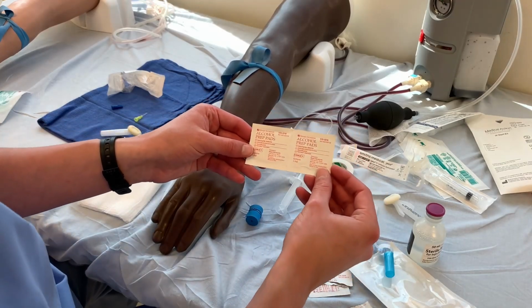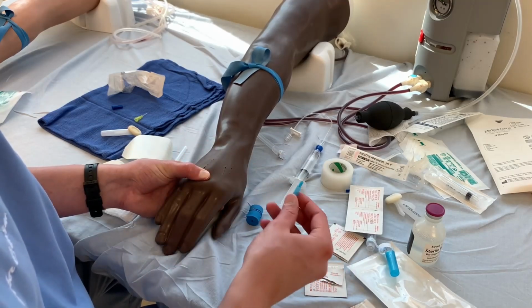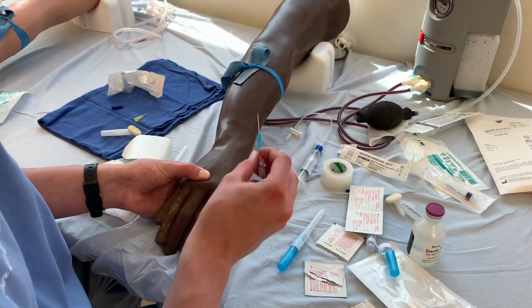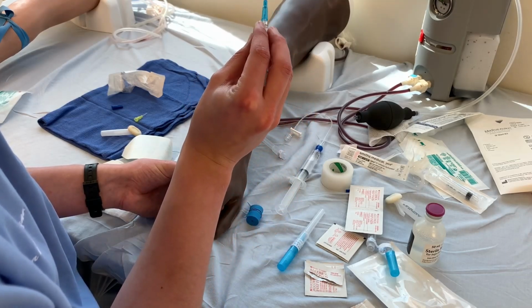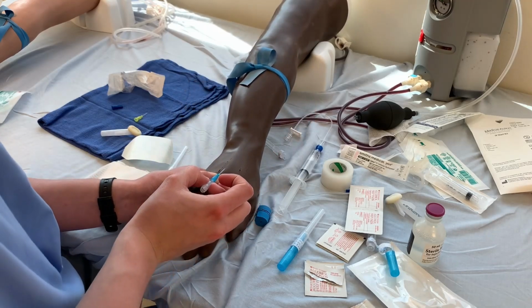It's important to clean the site that you're going to be giving the IV. You can use alcohol prep, you can use chlorhexidine, you can use any number of things. I'm checking which way the bevel is. You want the bevel up. That's the way we're taught, at least.